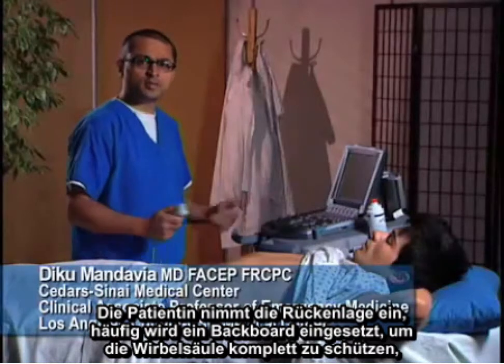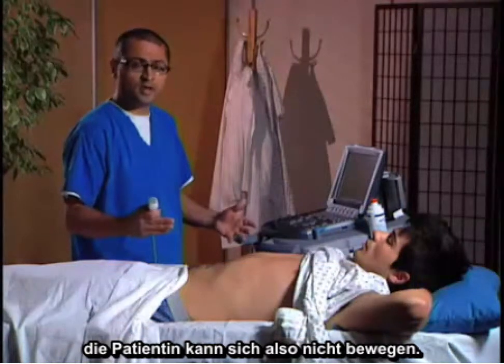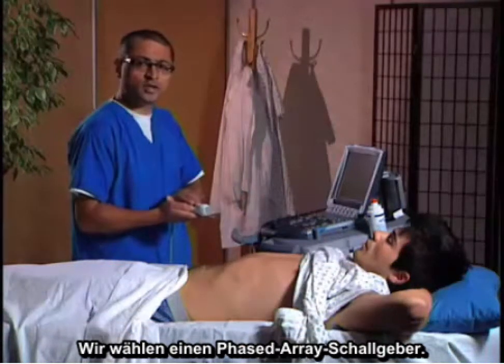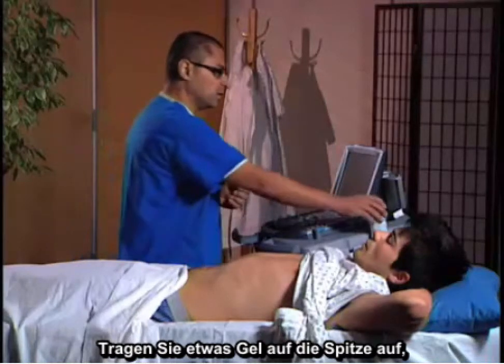The patient is going to arrive in a supine position, often on a backboard with full spinal precaution, so motion of the patient will be impossible. We're going to choose our transducer — we have chosen the phased array transducer — and put a little gel on top of it.